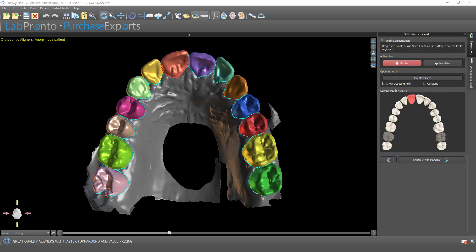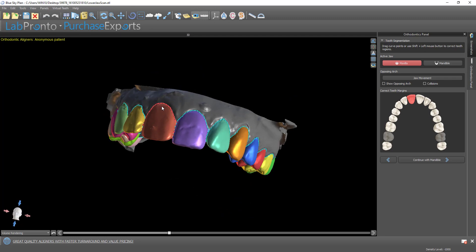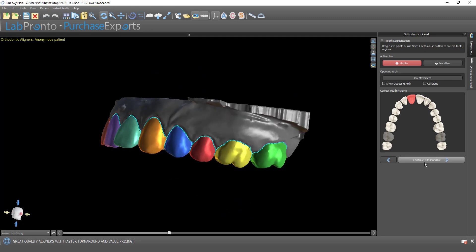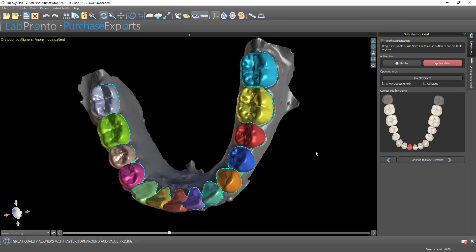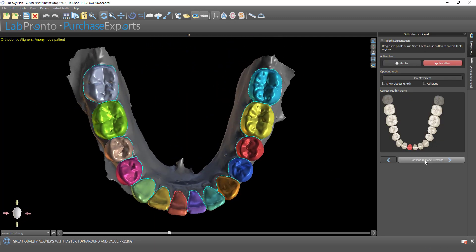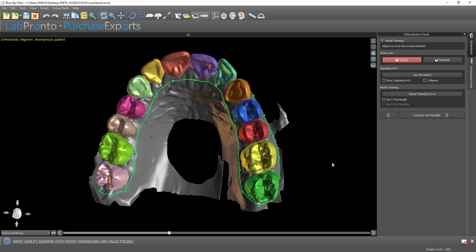Continue the teeth segmentation. Here we have the teeth automatically segmented by the software. Continuing with automatic model cleanup.